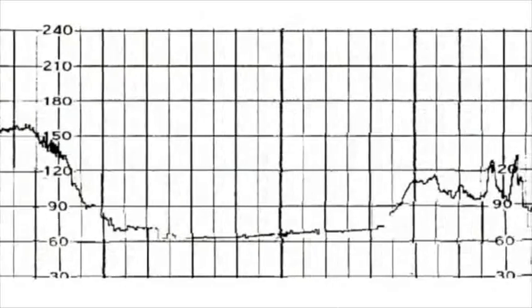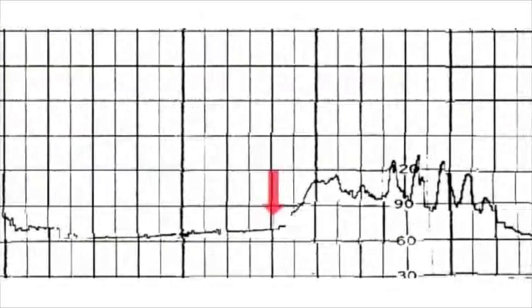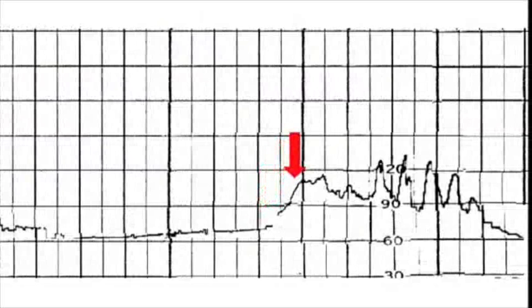The patient is turned on her side and additional conservative measures are employed. Two minutes later, the fetal heart rate rises to a rate of 100 beats per minute with a brief period of marked variability, presumed to be the result of this acute hypoxic event.